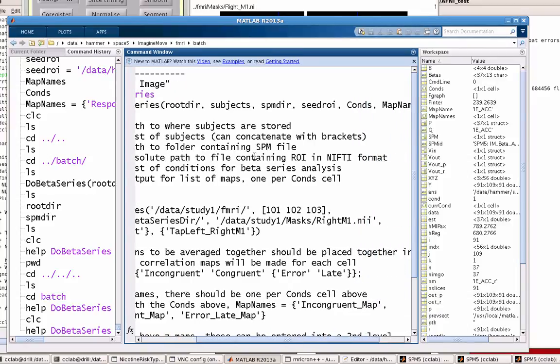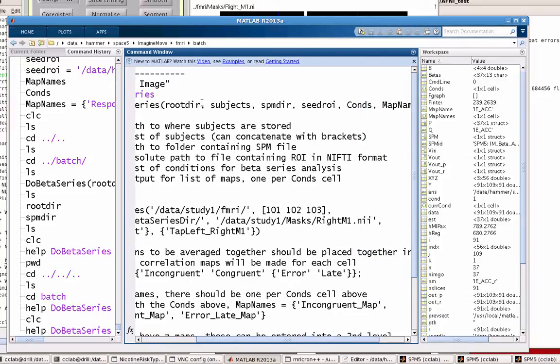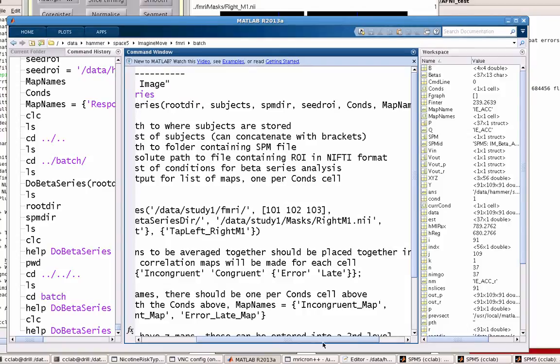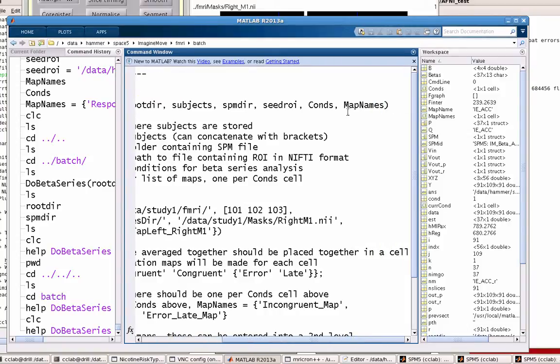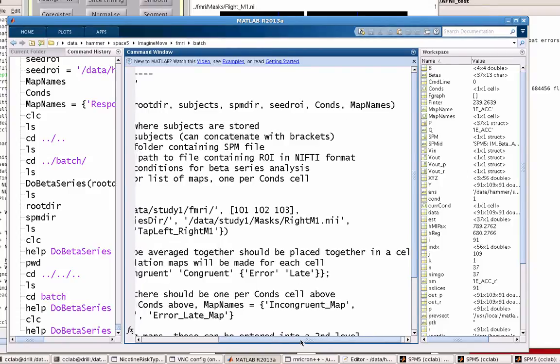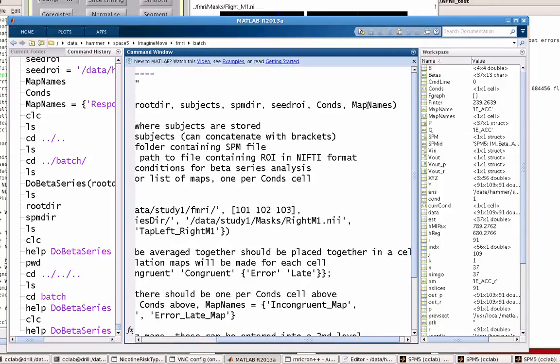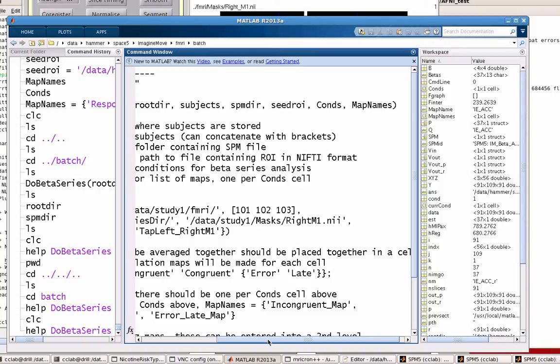So what this will require is basically a few different strings telling you where are all the subjects located, what subjects do you want to loop this over, and where is the directory that contains their spm.mat file that has these individual betas? You also specify a seed ROI, the conditions, and the map names. So a lot of this should be in the help, but if you want several conditions and if you want to average across a couple conditions for their beta series, you can do that. Just make sure they're in their each individual cell. And the map names will just put an output for each of those different conditions.